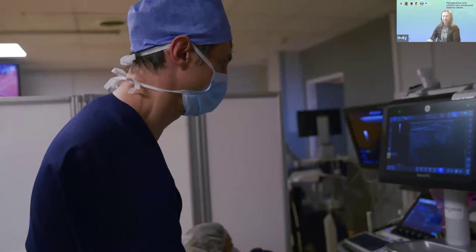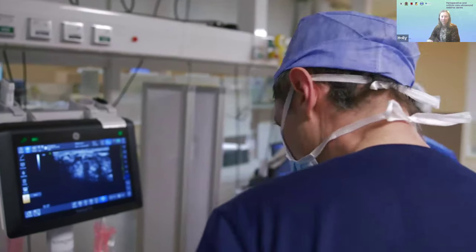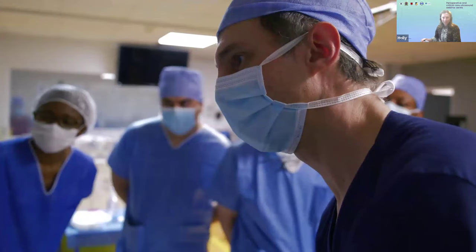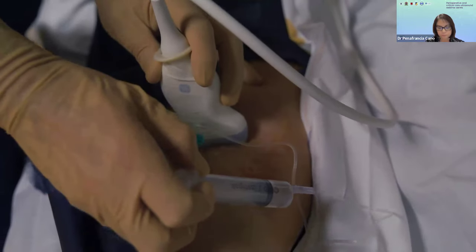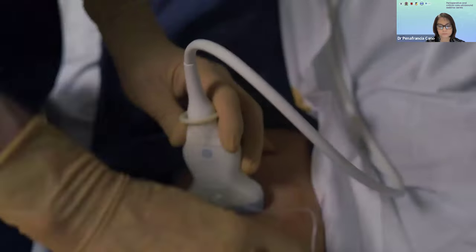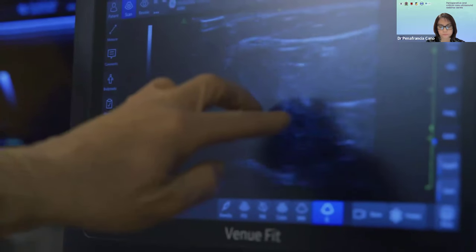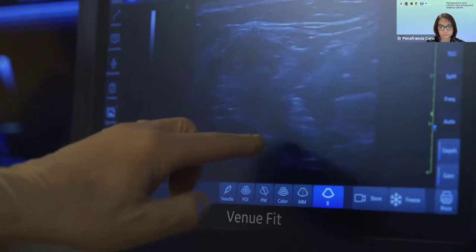It's done upfront. You have to inject very small amounts of local anesthetic to see where you are. And where, you see, where it's dilating here, it means that I'm in the right position. This is what I want. If we inject into a blood vessel, into a vein or into an artery, we should see it right away. We should stop immediately, otherwise this would lead to convulsions and even cardiac arrest. So this is very serious. And if we are too close, if we are inside the nerve, we could damage the nerve, and sometimes in a permanent way. So this is critical also for the safety. And actually, ultrasound helps us to evaluate very well the distance between the tip of the needle and the location of the nerve.